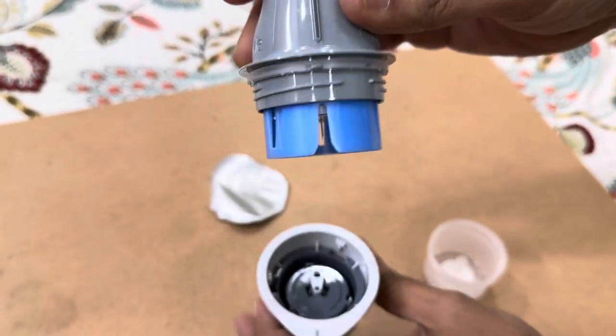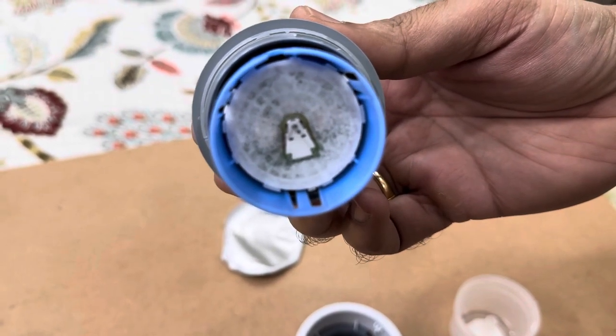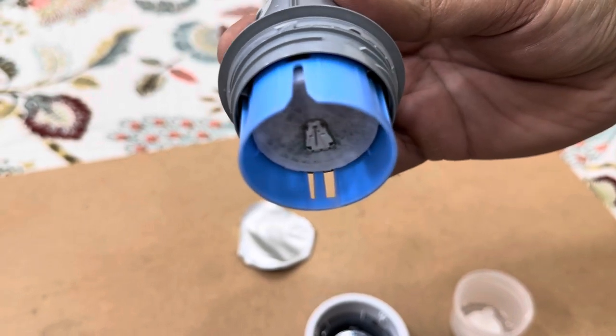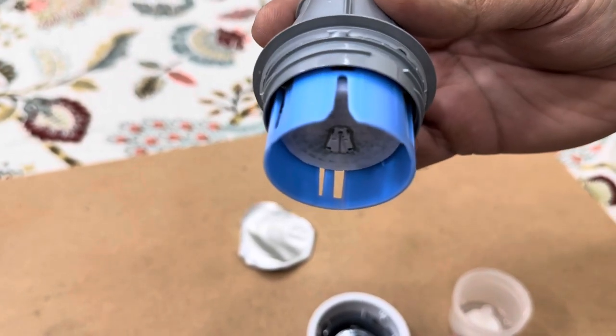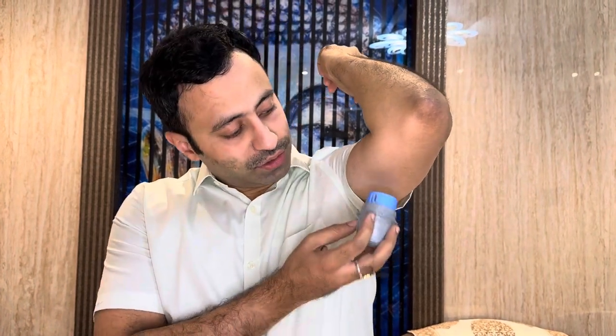Once opened, you can see there's a needle inside. This is how the needle looks. You can now directly apply it to your skin with the sensor placed into the applicator. I'm going to apply this for the first time — you should always keep the surface clean so it applies easily. It just goes on with a click — you keep it on the skin and click.